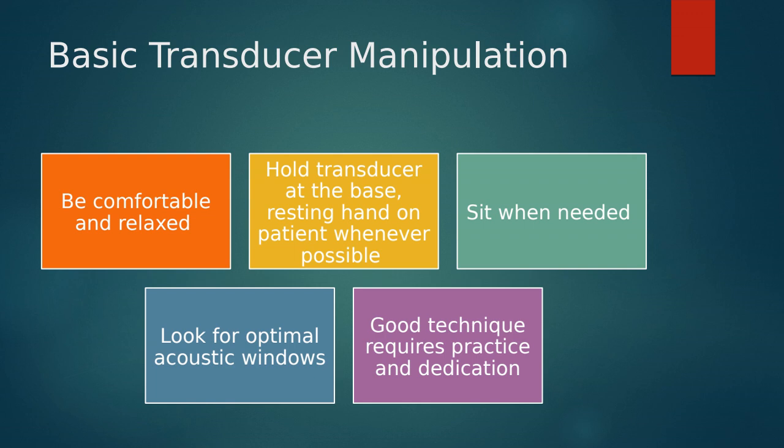Even when you are the patient with your partner, you can still watch that screen. You can still hear what I'm trying to tell your partner to do. You can still watch what I'm having your partner do. So even when you're the patient, you can still be absorbing all of that information that's going to help you out when it's your turn to scan.